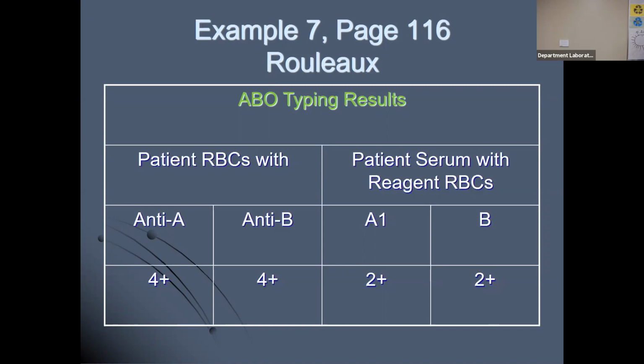And that's just to maintain their immunologic status, especially if they're being transfused. We want to know if they are actively building antibodies. I guess I was just wondering if it's not screened by hematology first before it even comes over to blood bank. If blood bank and hematology communicate with each other, you might ask hematology if they picked up on any rouleau or anything like that, but we still have to resolve our testing.